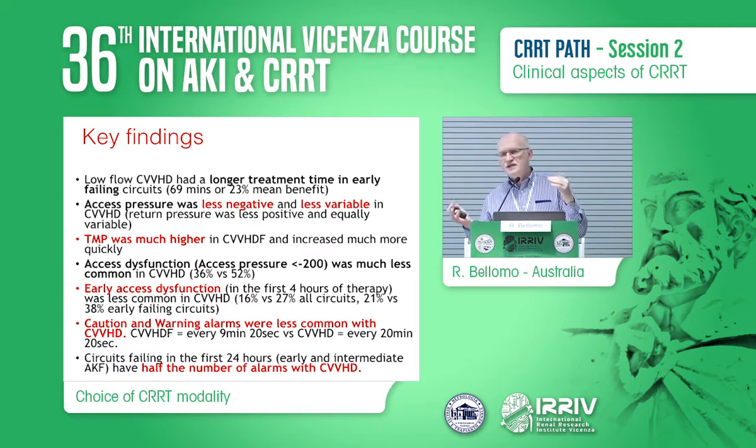Now, it's potentially because the patient has moved, or the patient has coughed, or the patient has sneezed, or the patient has been turned, or the bed has been modified, the patient has been set up. Whatever the reason, every 9 minutes, 20 seconds. That's amazing. If you do CVVHD, on the other hand, you change that to every 20 minutes and 20 seconds. This is like thousands of data points, right? And if you're operating in circuits that fail quickly, you actually have half the number of alarms with CVVHD.